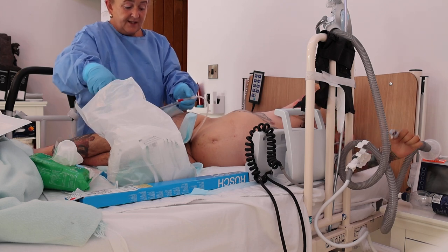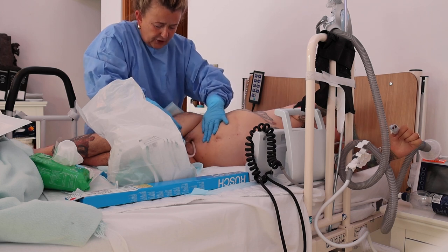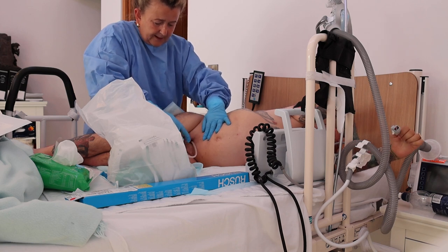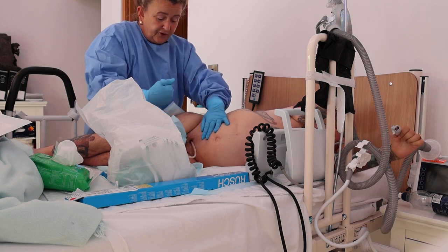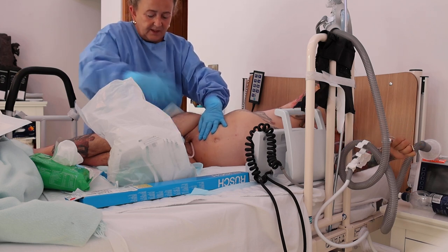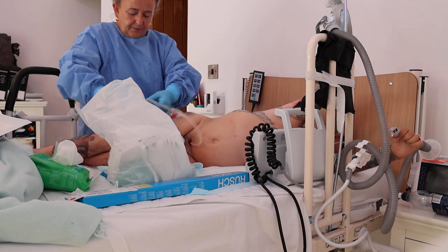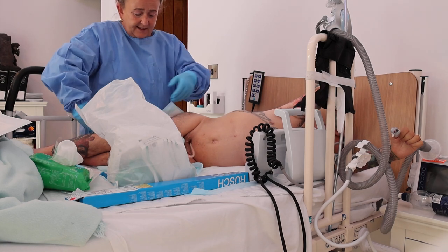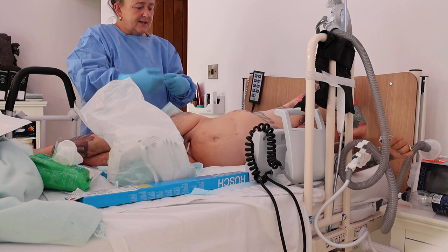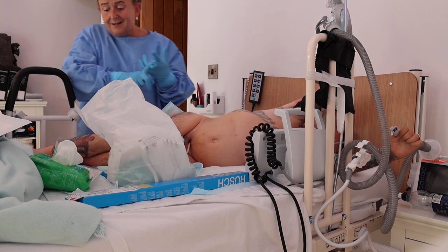I've got my bin and everything ready. As you can see, here's the stoma. It's been very bloody, and it's got over-granulation. The tube itself, to my naked eye, looks like it's got blood in it. I'm going to give him a set of antibiotics when we get him up. However, I'm going to go fully straight in now and get this out of him, because he doesn't want to be like he is, and we've done every step possible. I've got bladder wash, everything ready, and rescue meds.